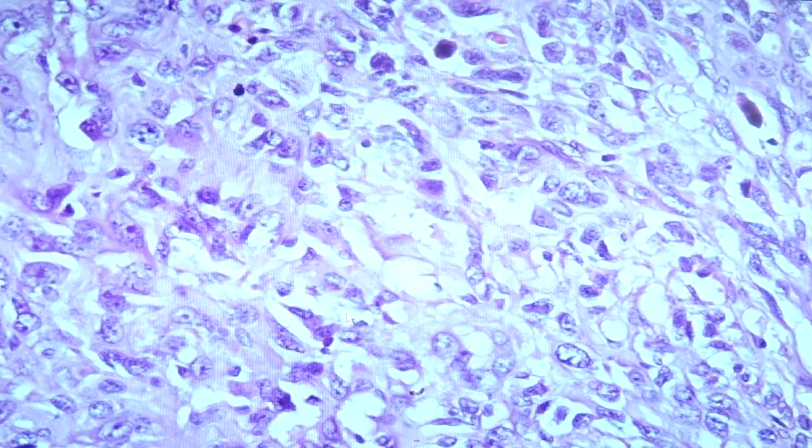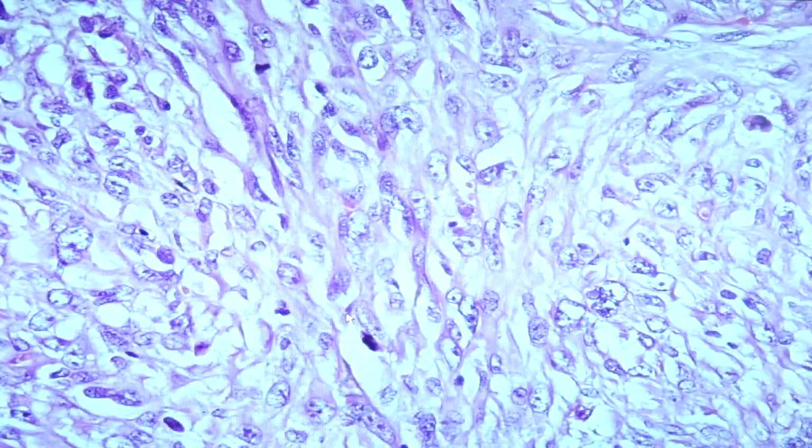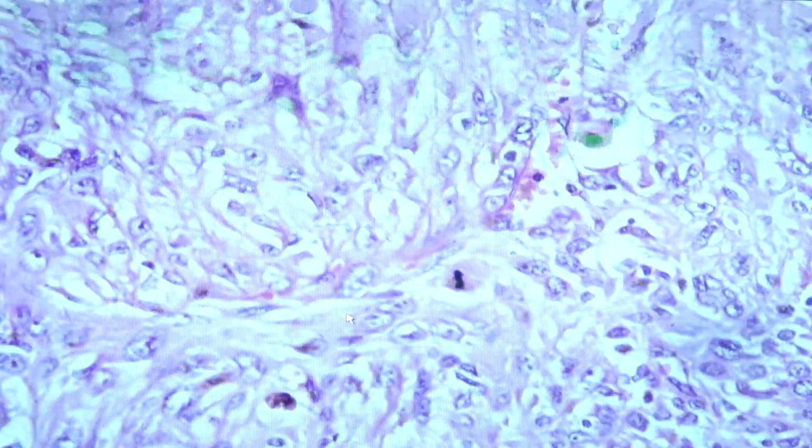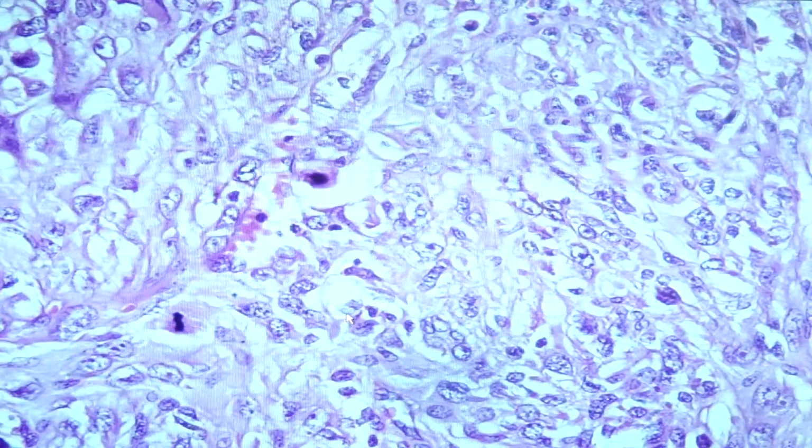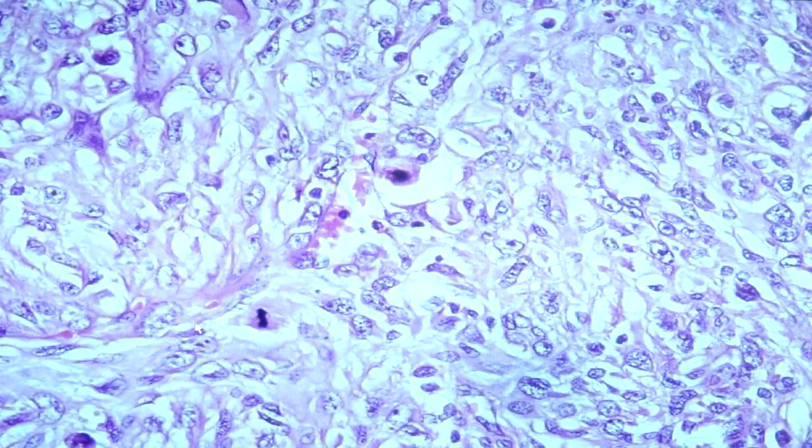In leiomyosarcoma, that would be one of the criteria for diagnosing leiomyosarcoma versus leiomyoma: the presence of a lot of mitotic figures and the presence of pleomorphism.